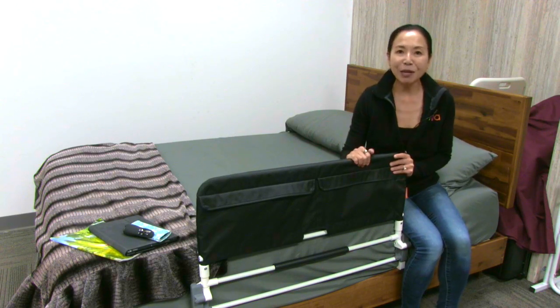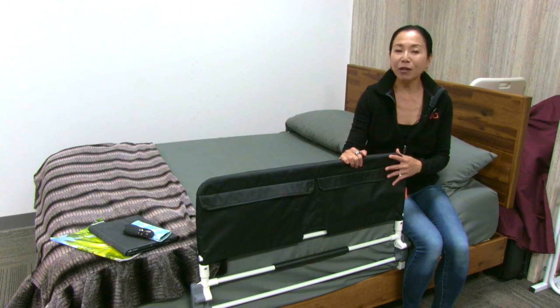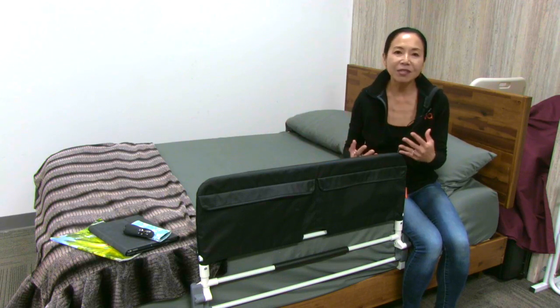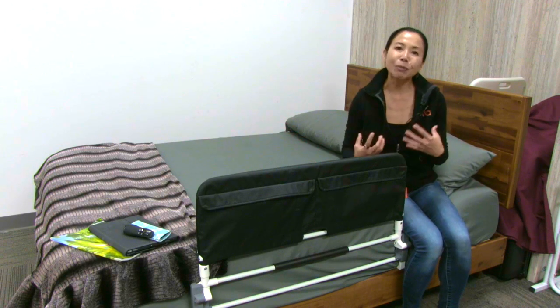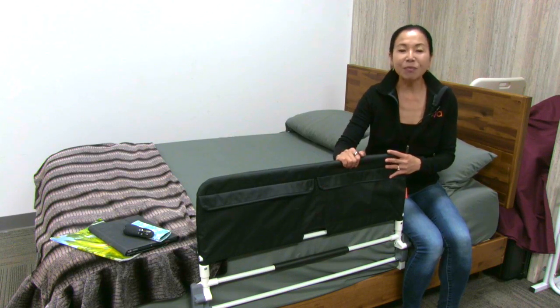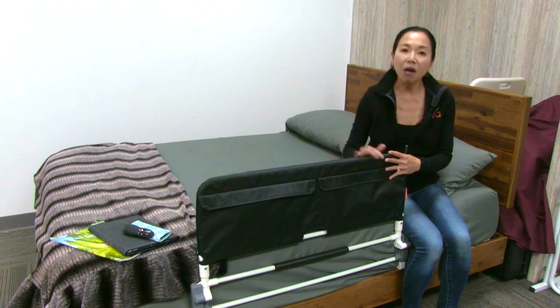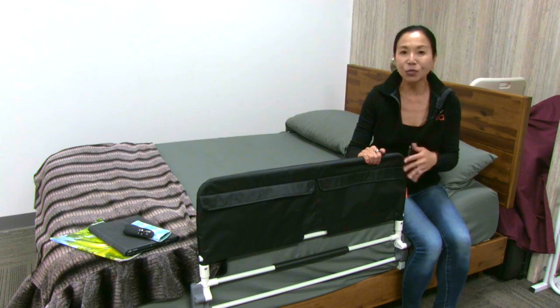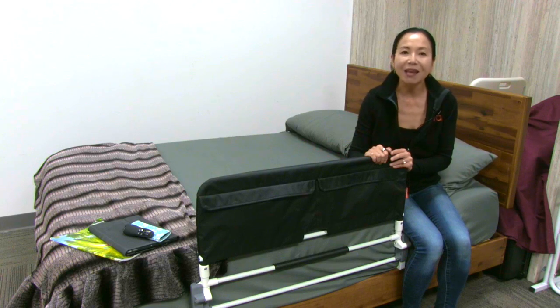Rather than looking at a bed rail as a guard rail, I look at this as a rail to embrace someone — to embrace the person in bed so they have safety and security. Just like when you put on a seat belt to keep you safe in your car or on an airplane, this is like a safety belt, an embraced guard rail to keep the person safe and secure, and also encourage their independence so they can get in and out of bed on their own and feel safe while resting and sleeping.